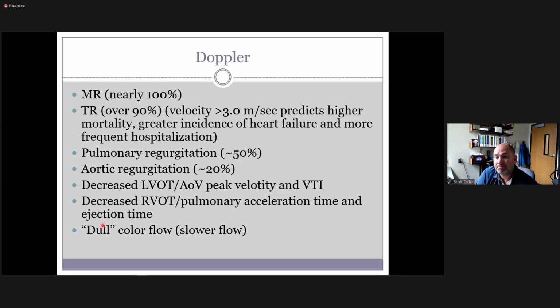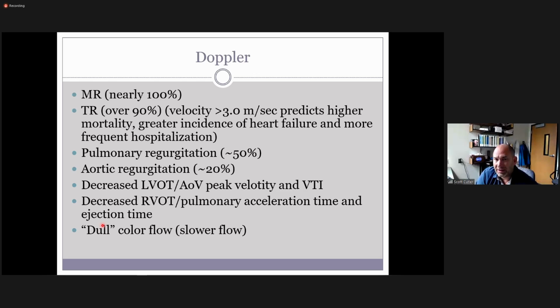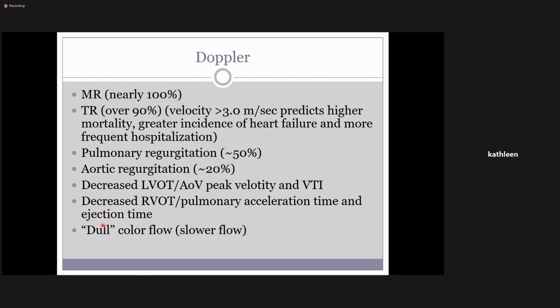Any other questions? Scott, how does that vary from the protocol we're already doing, our standard protocol? Seems like you're still doing the same things. Yep. My point in that is, what of those pictures is directly important information and what is irrelevant? Well, none of it's irrelevant. Isn't it more like, what are you primarily looking at, and what are you looking at for secondary to rule out?